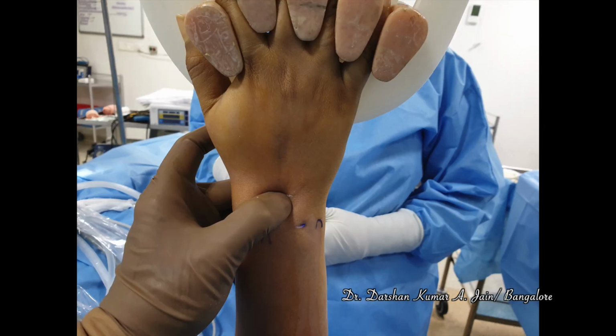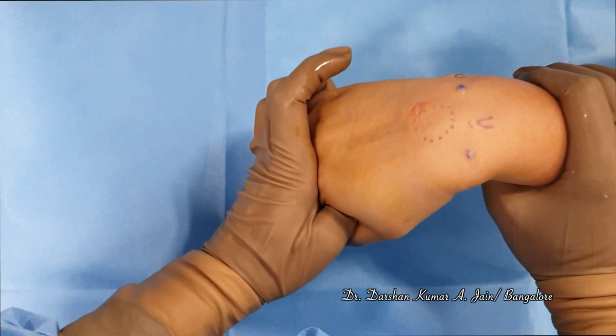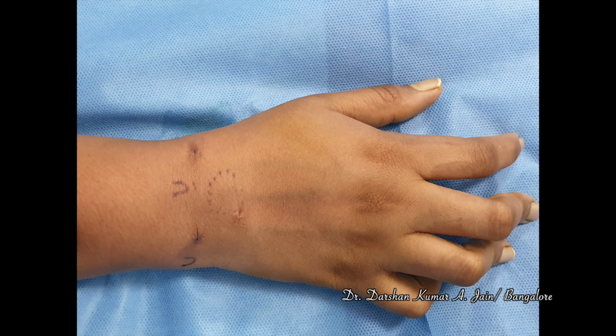This is the depression after excision, which you can see, and these are the movements. There's hardly any scar, which can be closed, or you can do a subcuticular closure.